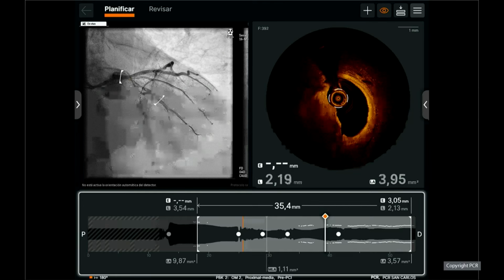You can see at the other side of the vessel it is not able to recognize the EEL because there is a lot of calcium, very thick. The thickness of the calcium is 1.3, so really thick calcium at this level. So I think based on this we can probably move to recheck the sizing we have done before.